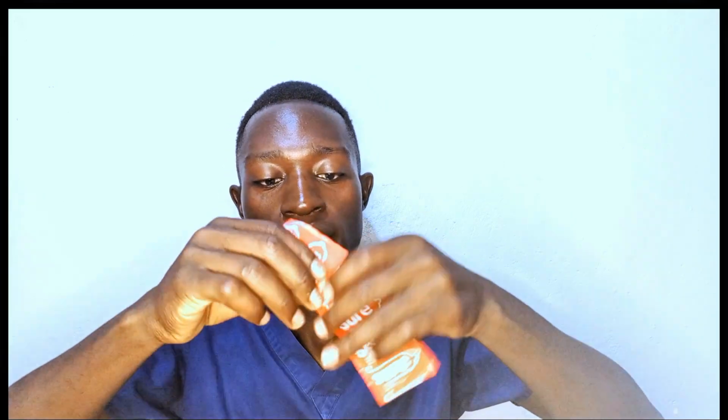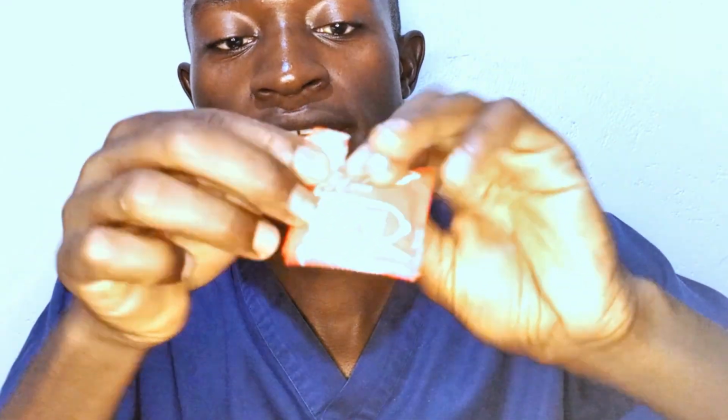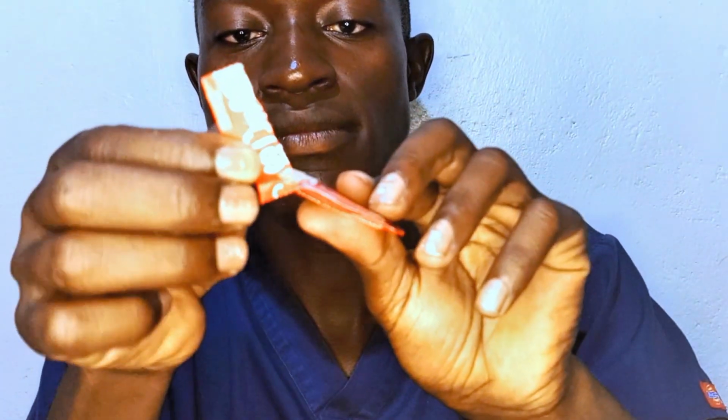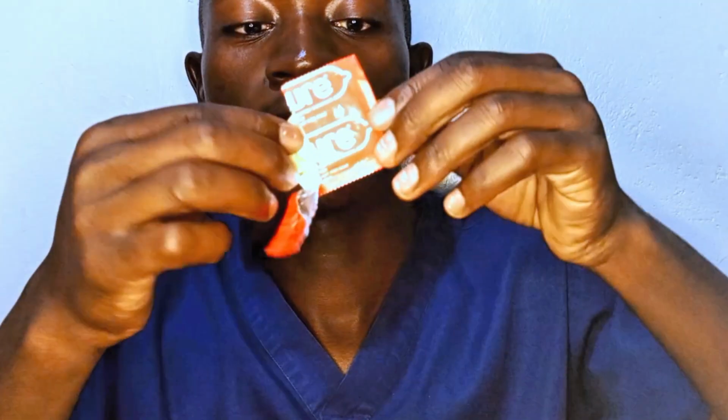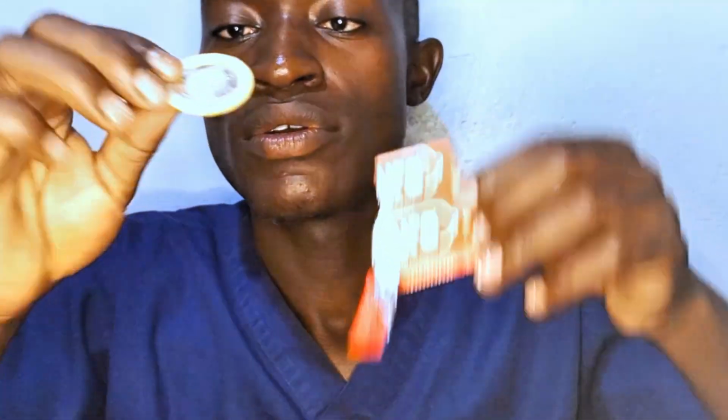So we are going to carefully open our wrapper. I'm going to use this one for demonstration. You just need to use your fingers, not any other tool, carefully, just like that. After opening, we remove our condom. I hope you are able to see this one.